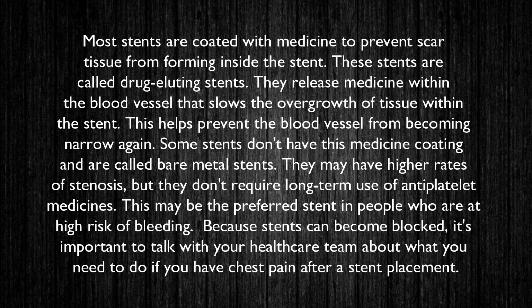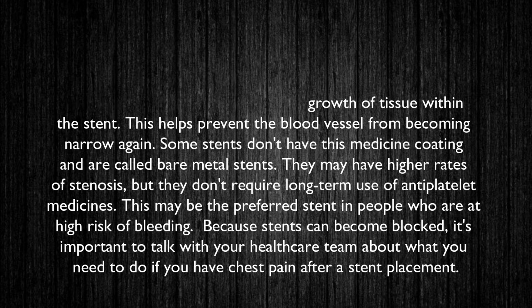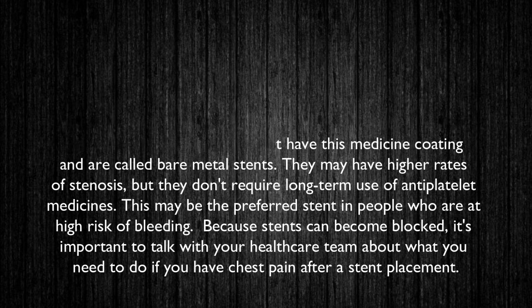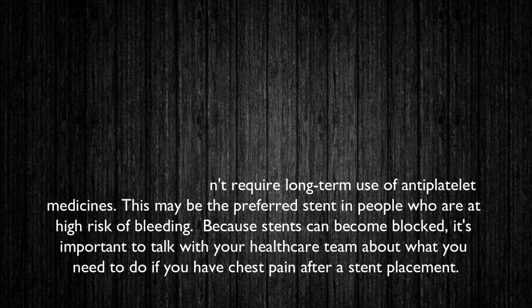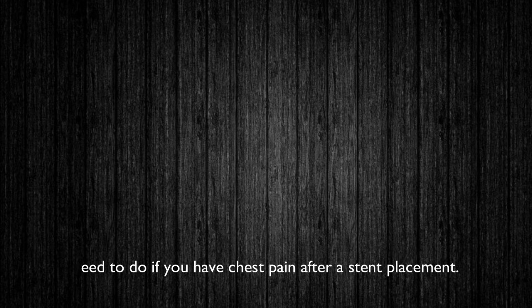Some stents don't have this medicine coating and are called bare metal stents. They may have higher rates of stenosis, but they don't require long-term use of antiplatelet medicines. This may be the preferred stent in people who are at high risk of bleeding. Because stents can become blocked, it's important to talk with your healthcare team about what you need to do if you have chest pain after a stent placement.